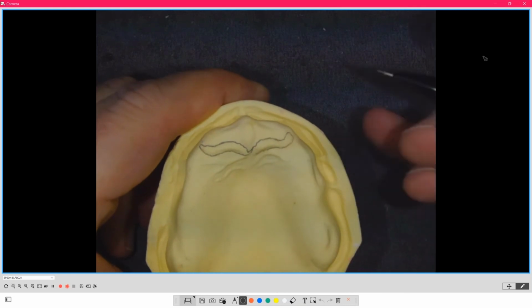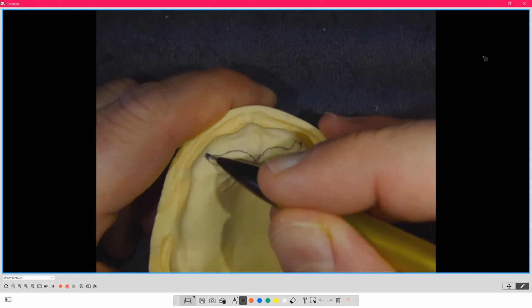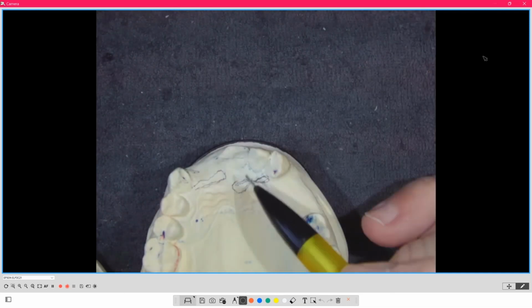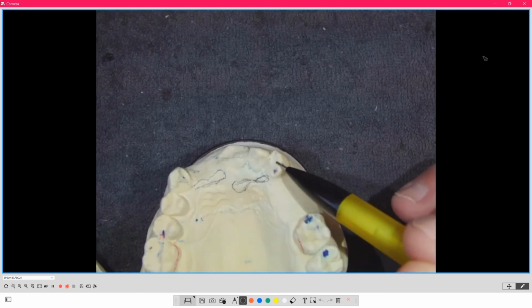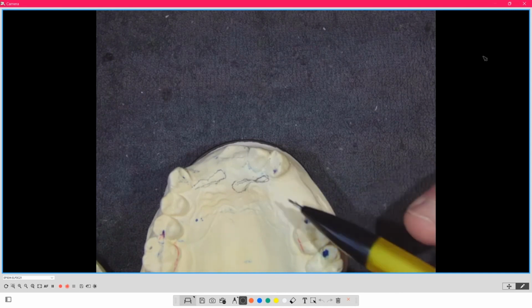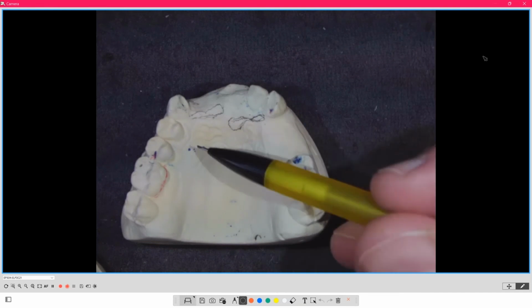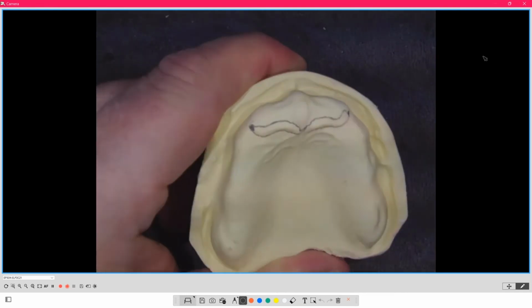So what the long branch rugae does is it points to the cuspids. So we're getting into a little bit of model analysis. What model analysis does is the rugae of a person actually points to where the cuspid should go for that person, based on, what's the key word of the day? Architecture of their mouth. So now it's given me a guideline of where to put things.